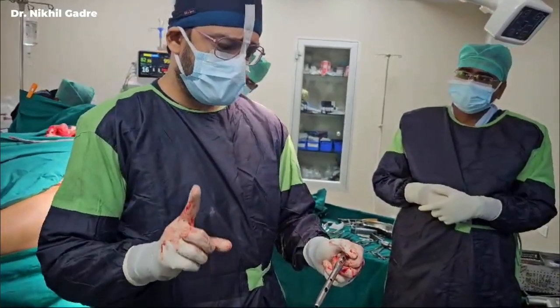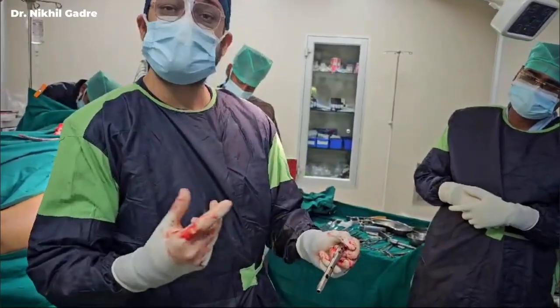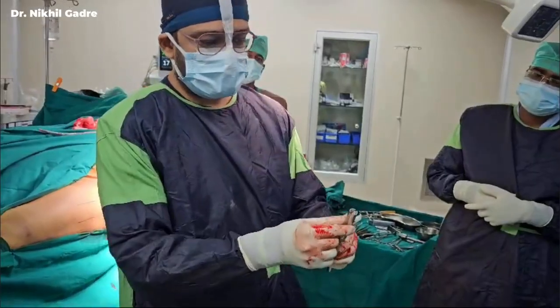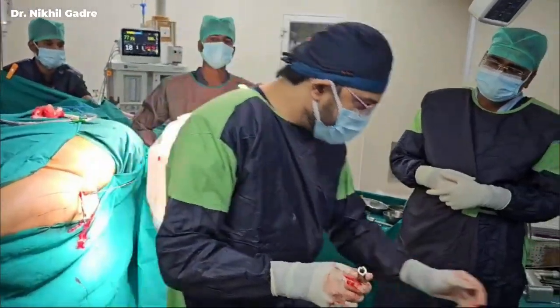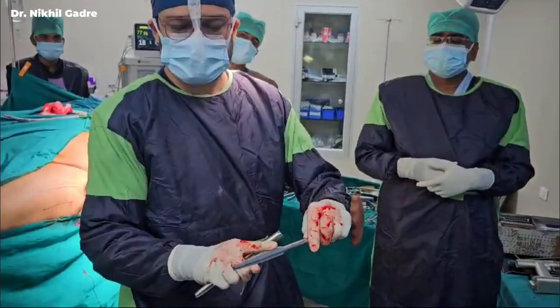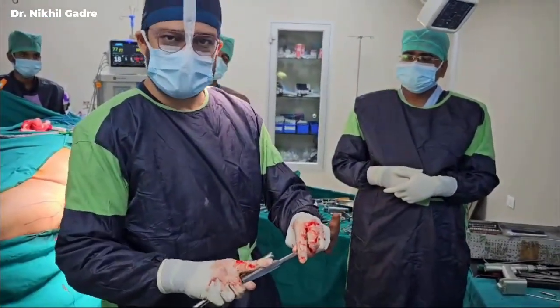So a very common mistake which newcomers make is they calculate, okay, we have to do an 11 mm ream and we have an 11 mm nail. So they ream up to 12 mm and try to put an 11 mm nail. But this proximal diameter is around 15 to 16 mm for standard nails. So for that, you have to initially ream the proximal end with this reamer. The diameter of this proximal entry reamer is 16 to 17 mm in standard PFN sets.